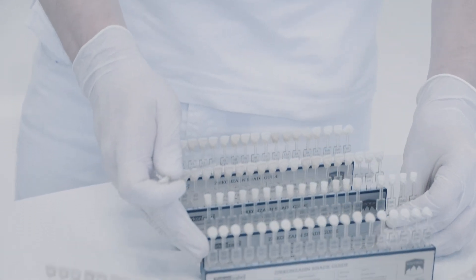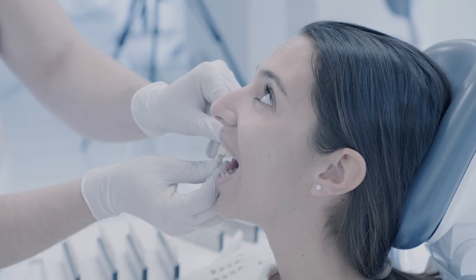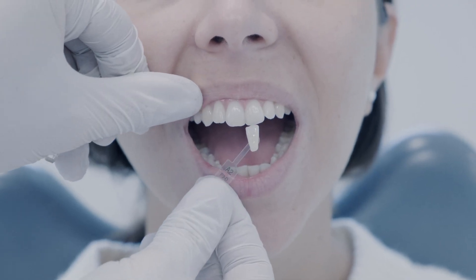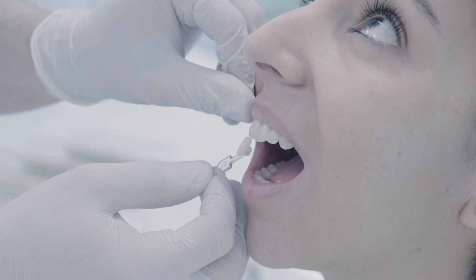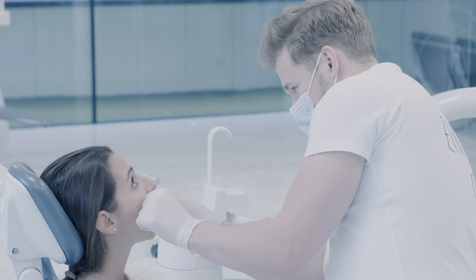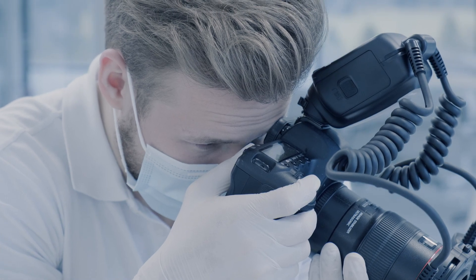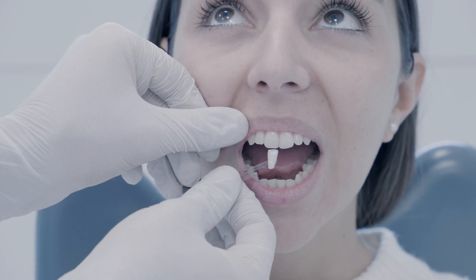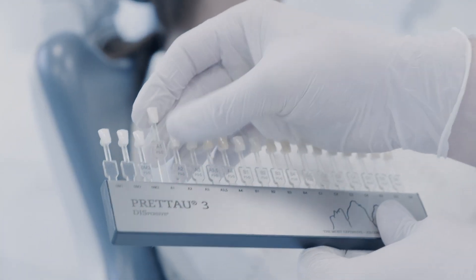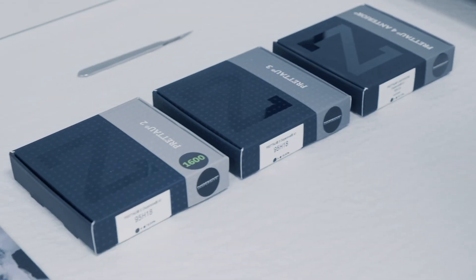Hold the shade guide in the shape of a lower incisor against the natural teeth to determine the natural tooth shade for a monolithic lower jaw structure to be fabricated in pretout dispersive zirconia, or to check the interplay with the natural residual teeth or an already fabricated zirconia upper jaw structure. An exact determination of the natural basic tooth color is fundamental for the artificial reproduction. Professional literature recommends always using the shade guide of the material that will later be used for the restoration.